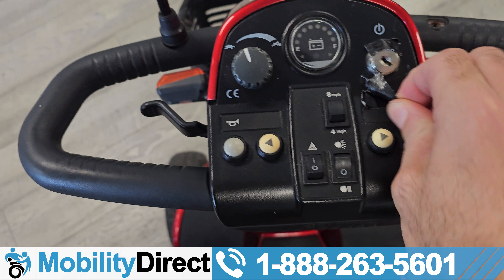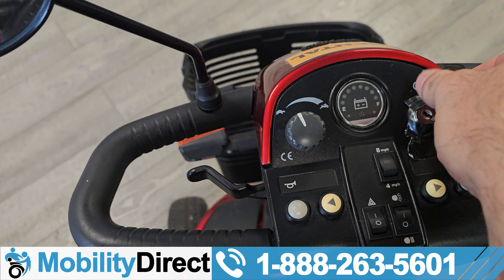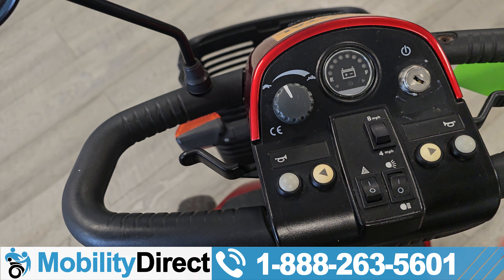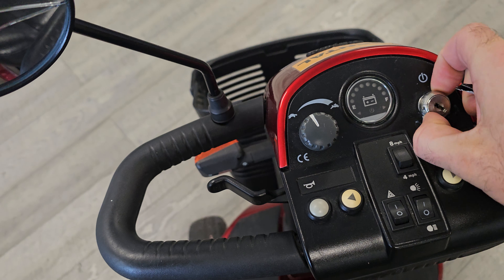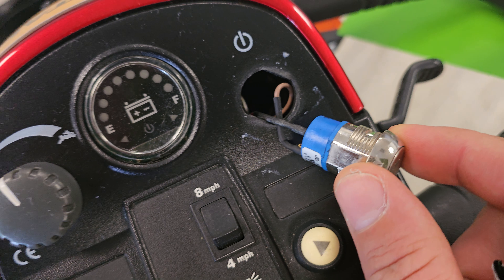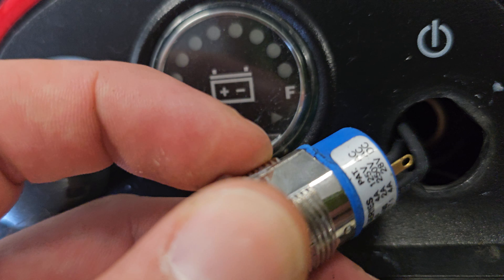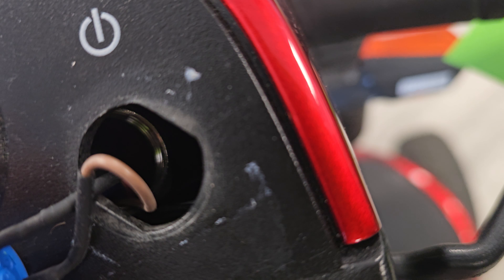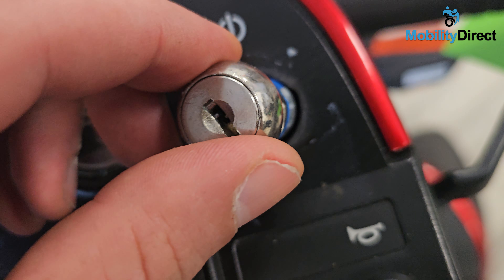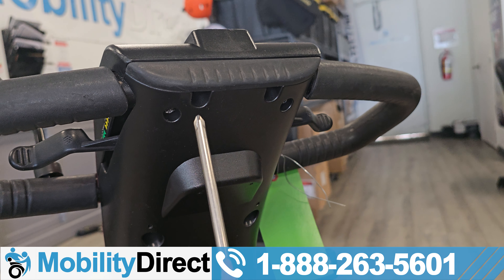On this console, you can see the barrel of the ignition going through the plastic, and there's a retaining lock nut on the back side that tends to get loose. After thousands of times turning the scooter off and on, and from the vibrations of all the bumps you endure, it'll loosen over the course of use. This is common after significant use — not something to worry about on a new product, more towards older units.